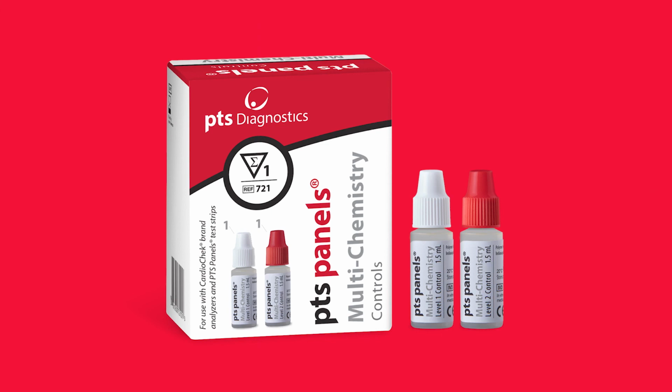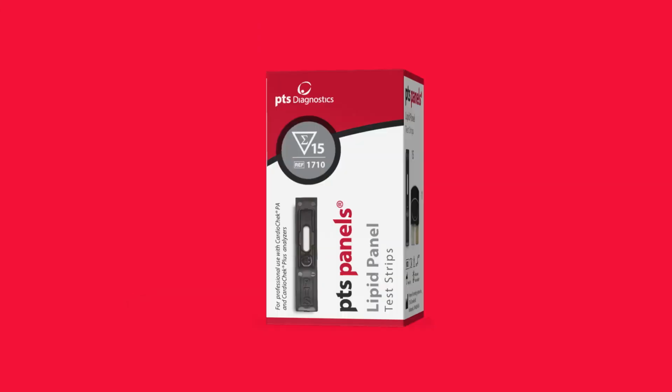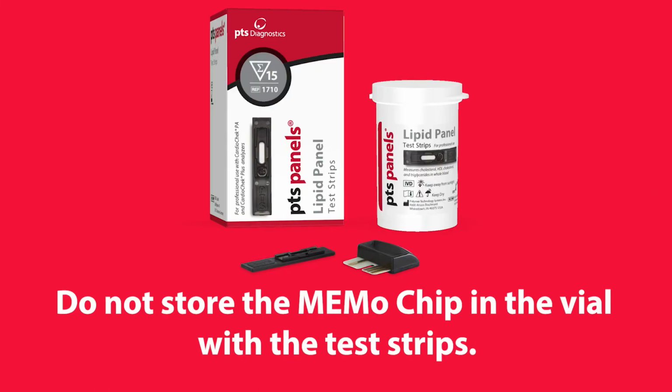Store the PTS panel's control materials and test strips at the temperatures indicated in their package inserts. Store the memo chip in the box with its original lot of test strips. Do not store the memo chip in the vial with the test strips.